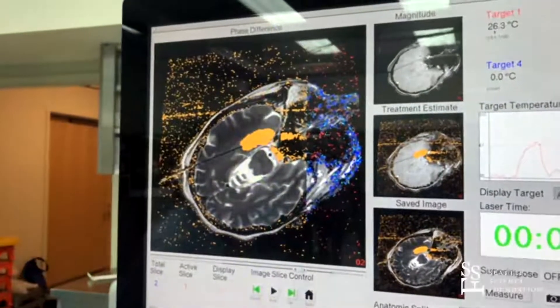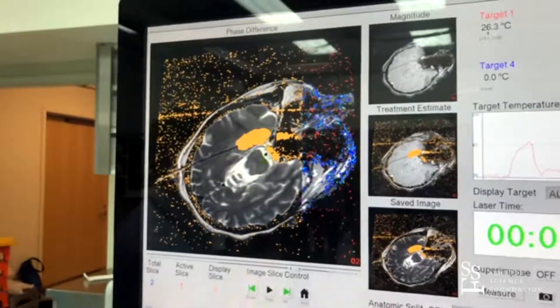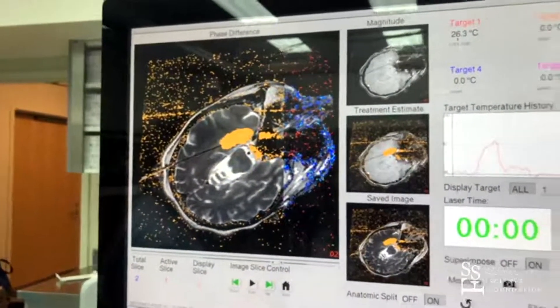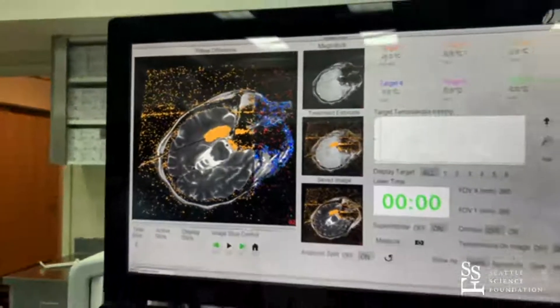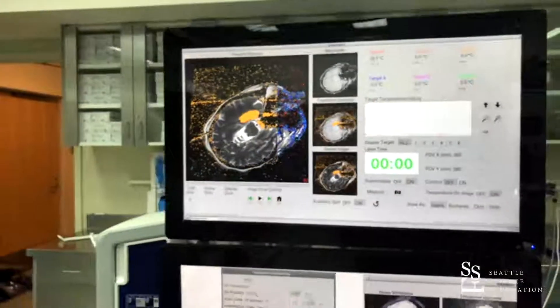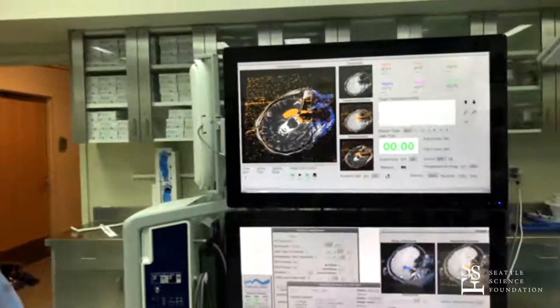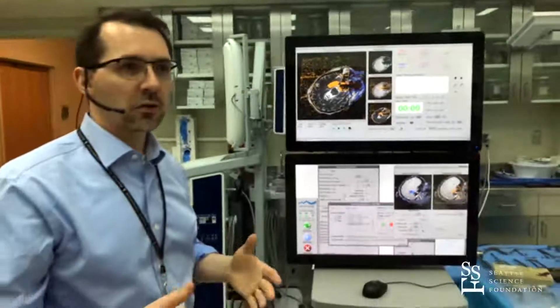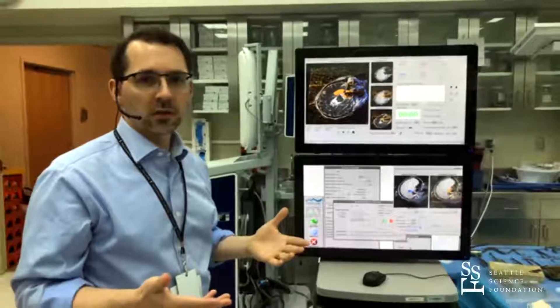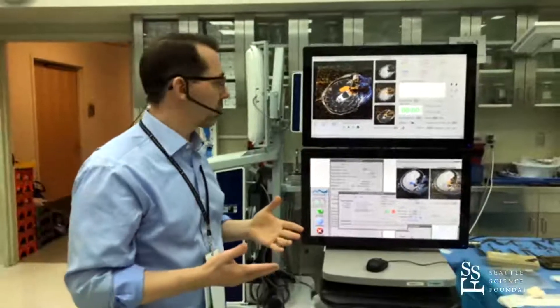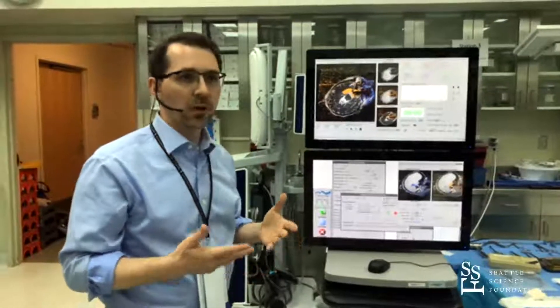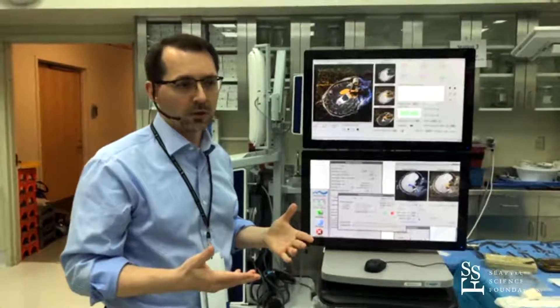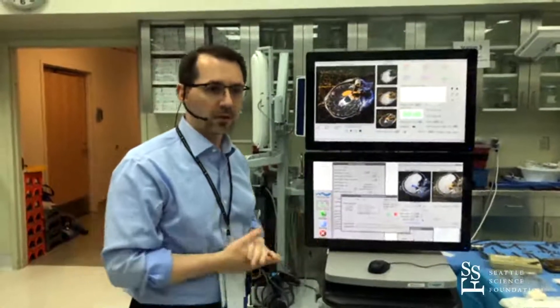This looks like a nice ablation. At this point we would stop, get anatomical imaging — FLAIR, T2, diffusion, T1 post-contrast, and anything else needed to confirm that the ablation has occurred and make sure we've accomplished the goals of the procedure.